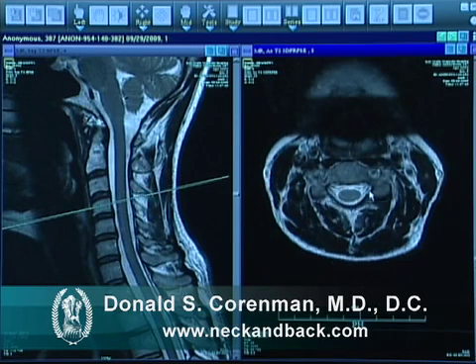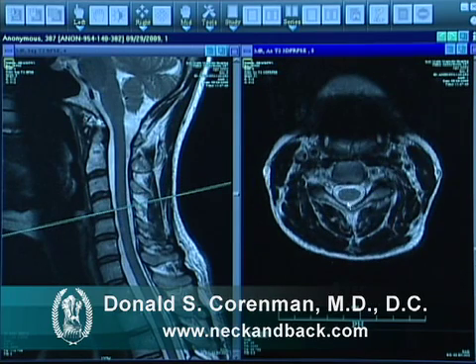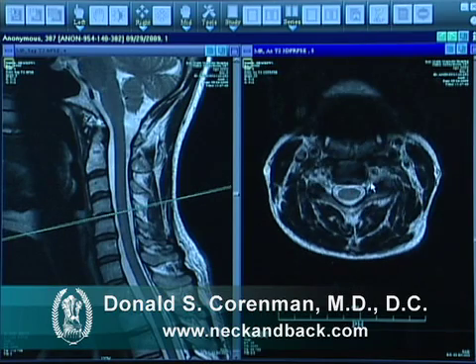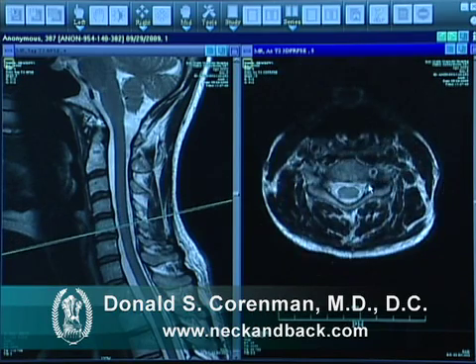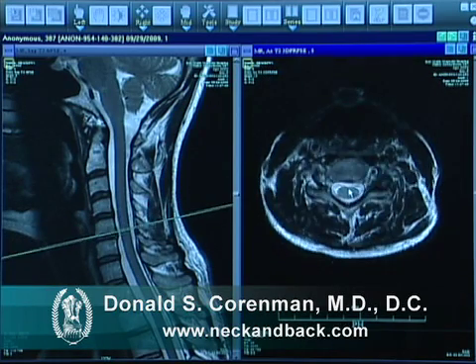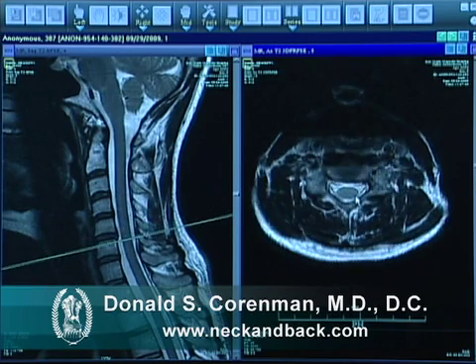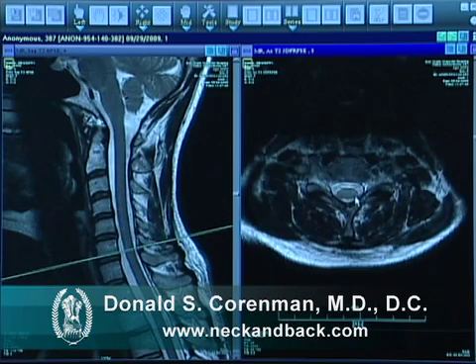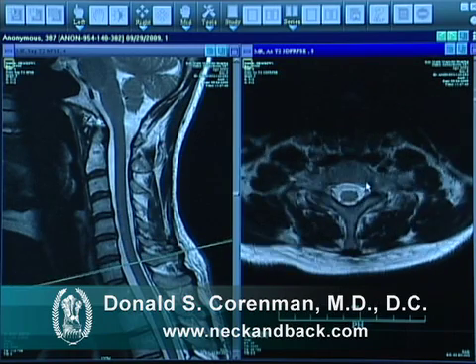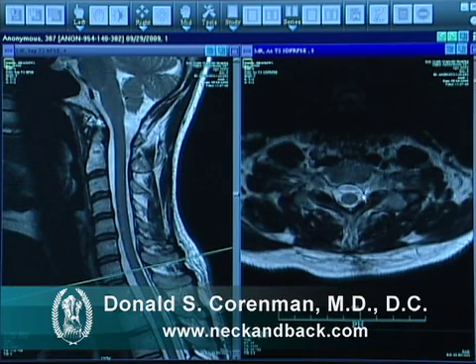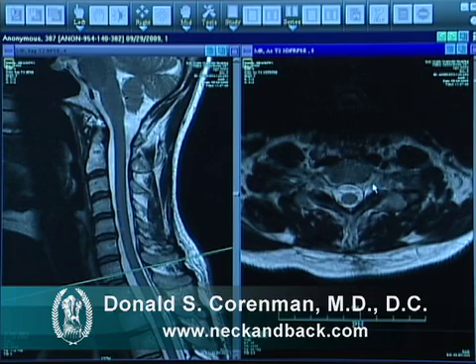We can march down to the next level and again see the normal cord and normal nerve exit zones, and continue down through the spine looking at C5-6 with normal exit zones, then C6-7 with normal exit zones, and even C7-T1 with normal nerve exit zones. So this defines a normal MRI of the cervical spine.